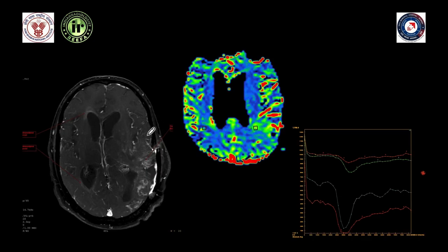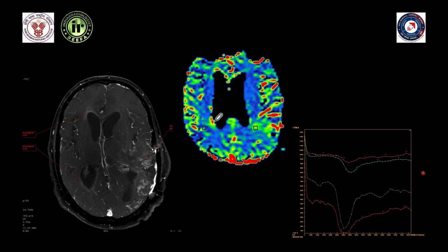Perfusion imaging is also a very good technique for response assessment. In a glioblastoma treated with radiotherapy and temozolomide, heterogeneous post-contrast enhancement in the left fronto-temporal region with hyperperfusion implies residual or recurrent tumor. Sub-ependymal areas of enhancement showing hyperperfusion on DSC maps suggest sub-ependymal disease spread — tumor progression rather than pseudo-progression.